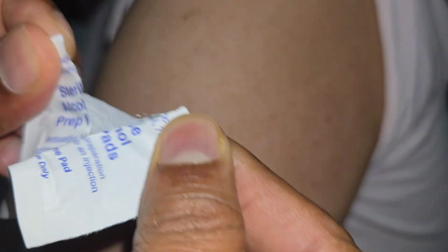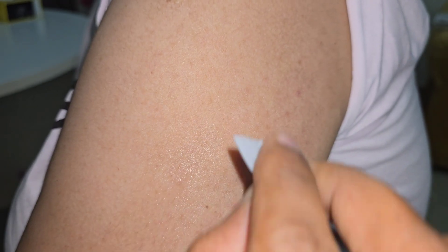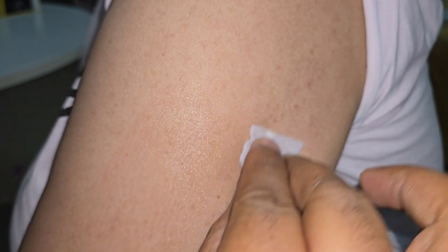Now we need to prep the area before applying the sensor. Take an alcohol pad and rub the area thoroughly. This area should be clean and dry, so make sure there is no lotion or oil on your skin.